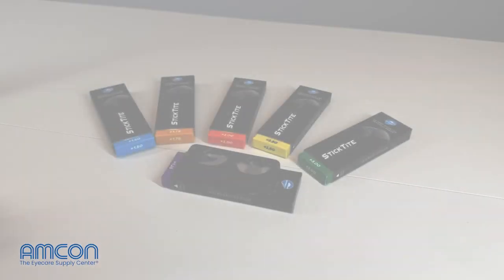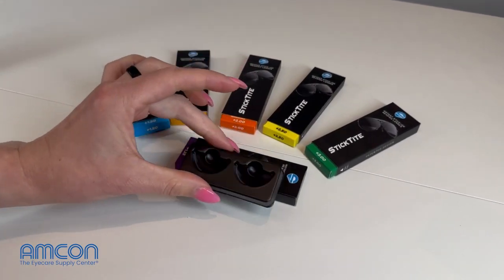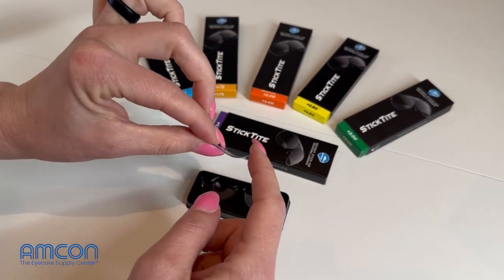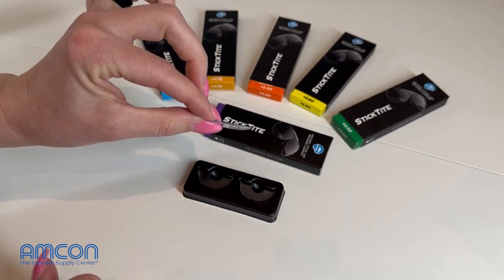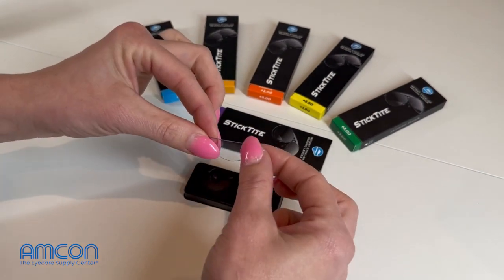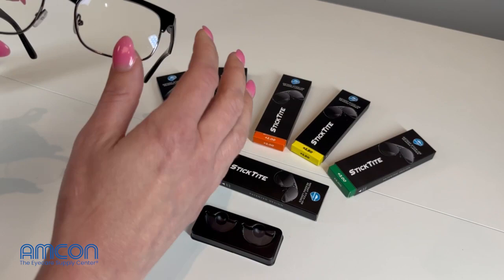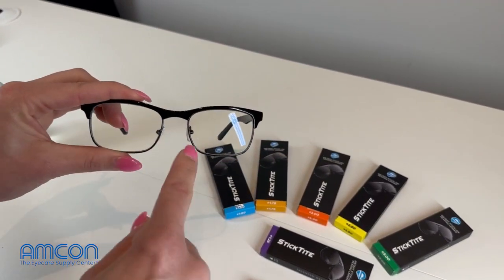Here we have our new StickTight Instant Reading Lenses. These lenses are made of a very flexible polymer and as you can tell they're very thin, so they're going to be very easy to work with. So what you want to do, go ahead and clean your glasses thoroughly before applying these.